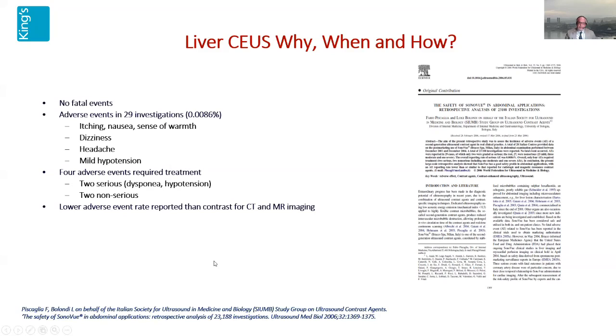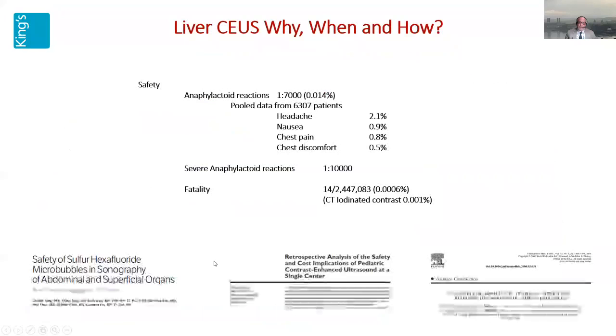And this has held over the years with other examinations looking at the safety, and I draw your attention to this study of 30,000, which reported similar safety issues, and also this study in pediatric patients, which also showed a low incidence of adverse events.